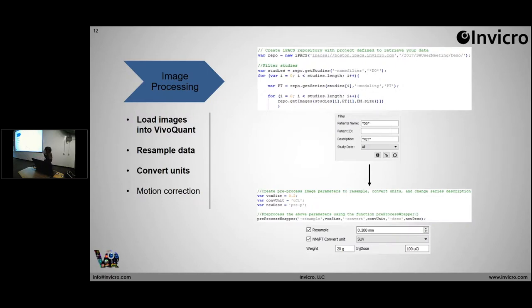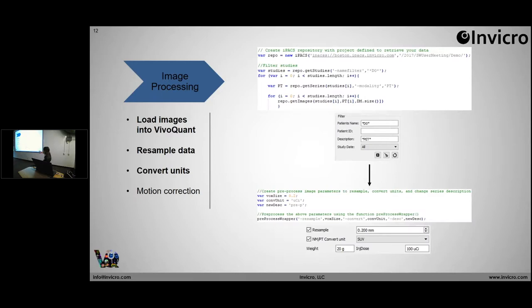You've just run a study and now have data loaded onto the IPACS. The first thing you want to do is load in your images and do some preprocessing — resample your data and convert your units. You can see at the top that's just scripting: go to this IPACS, filter the data based off these parameters, and then load it all in for each image. There's an equivalent in VQ in the actual UI for doing that for a single patient — filtering by patient name, time point, and modality. But if you do it in VivoScript, you can batch-process. Then I preprocessed using the preprocess wrapper function, equivalent to the preprocessing tool within VivoQuant — resampling and converting within that script. Super simple and easy to use.